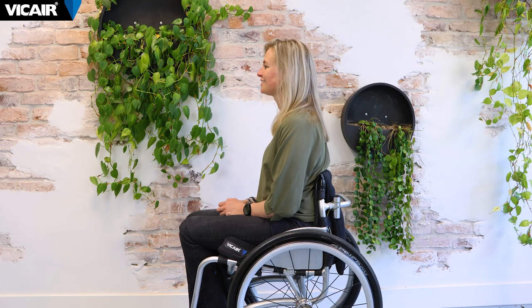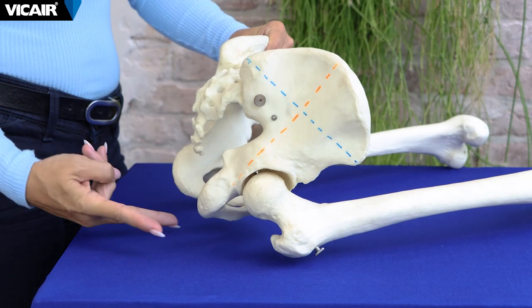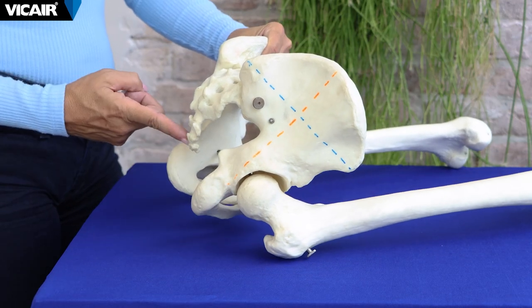In this video I will go through the steps on how to check for bottoming out. Bottoming out means that the user sinks into the wheelchair cushion and makes direct contact with the underlying seating surface. Bottoming out typically occurs around bony prominences such as the ischial tuberosities, trochanters, and coccyx area.